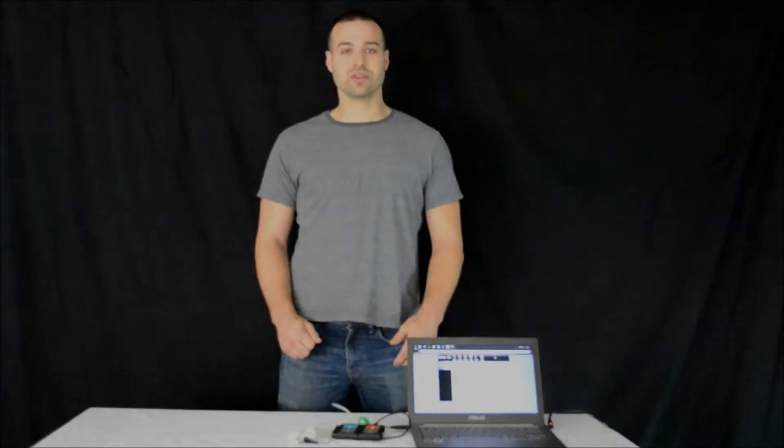The NuLog Galvanic Skin Response Sensor is used to detect someone's emotional response to a stimulus, whether it's smell, touch, or sound.